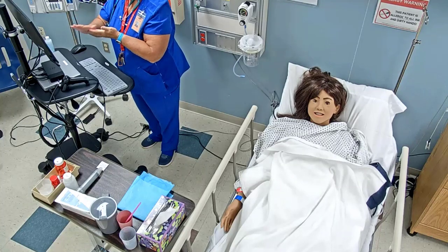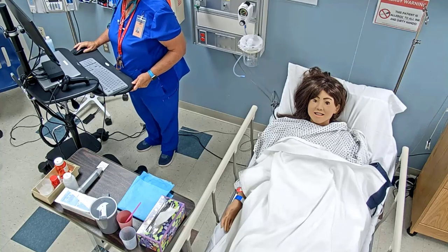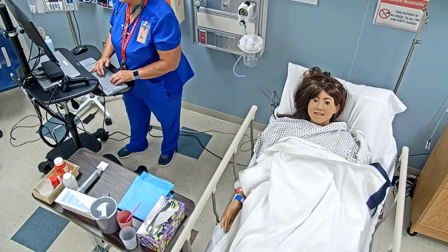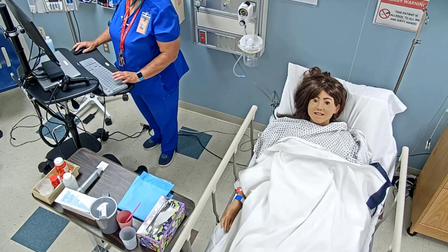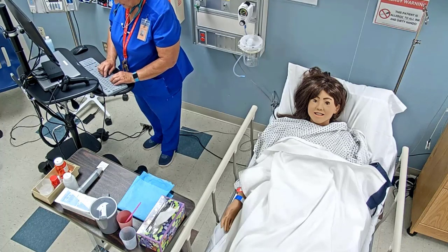And so let me come over here to my MAR, and on my metoprolol, I'm going to put my initials. And I'm also going to put my apical pulse was 80, which was within the parameters. Normally it says if it's less than 60 to hold, and my blood pressure was 118/80, and a lot of times they say if the systolic is less than 100 to hold it, but your parameters were all good.